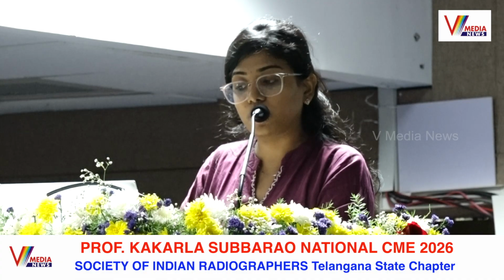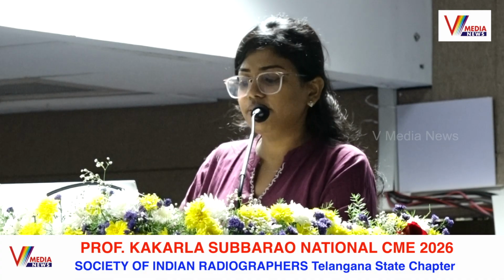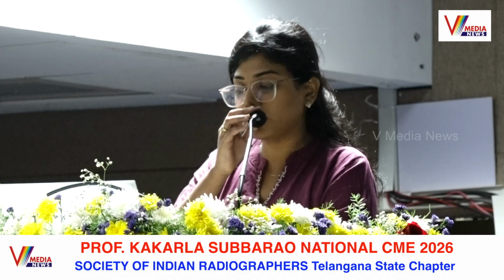So we can characterize the coronary plaque based on the coronary artery calcium score into mild, moderate, severe, and extensive. If it is extensive, we can stop the CTA scan.